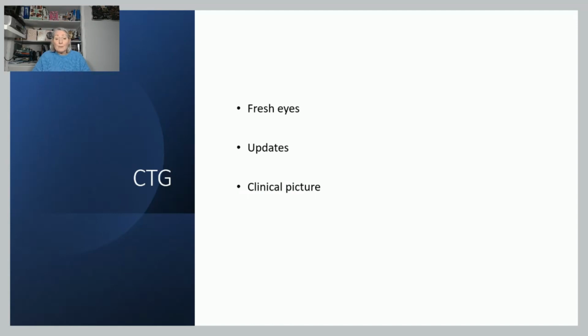So, as the second person going in to look at that CTG, you should do so with an open mind and look at it with your own perspective, not be influenced by anyone who's already been in the room looking at it. It's always useful every couple of hours, I would say, to get a senior midwife to do your fresh eyes.